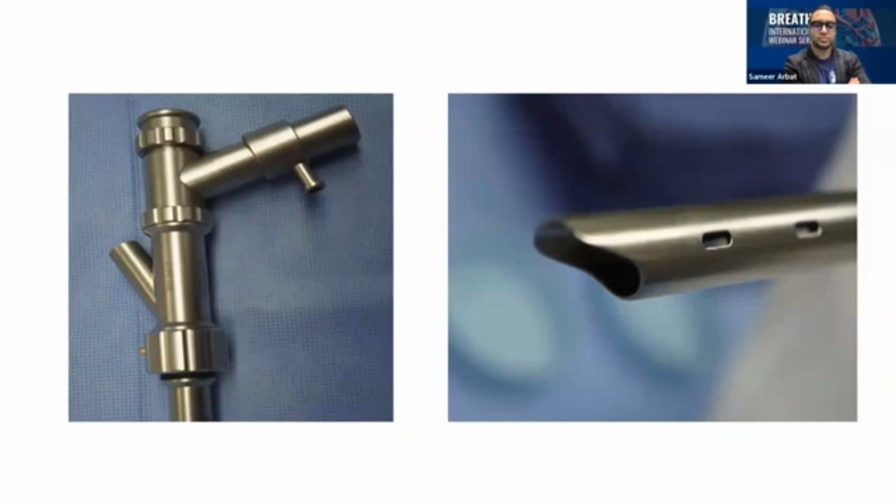What you need to understand is the distal end of the rigid bronchoscope. There are two different types of rigid scopes. One is called a rigid tracheoscope. In the rigid tracheoscope, you don't have the fenestrating holes which are used for ventilation. But if you see a rigid barrel with fenestrating holes at its distal end, then it is a rigid bronchoscope. That means you can put it inside one bronchus and simultaneously ventilate the other bronchus and the other lung.